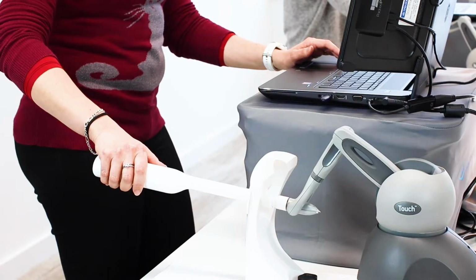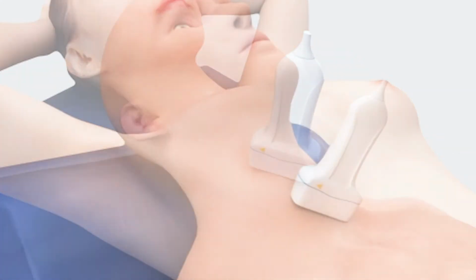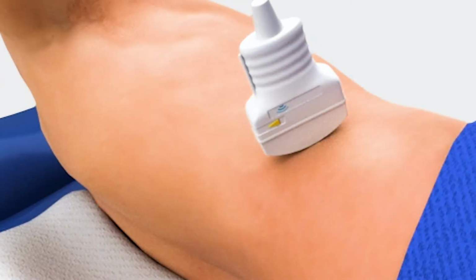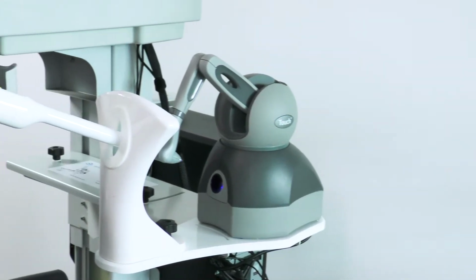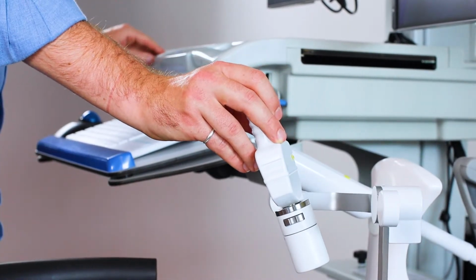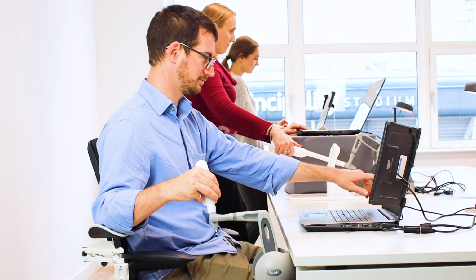ScanTrainer uses haptic devices alongside virtual patients with realistic landmarks to replicate multiple patient shapes. In this way, the system's 15 different virtual patients replaces the need for 15 mannequins. ScanTrainer uses two haptics, one for transvaginal scanning and one for transabdominal, though the new compact system uses just one for both, making it highly portable.